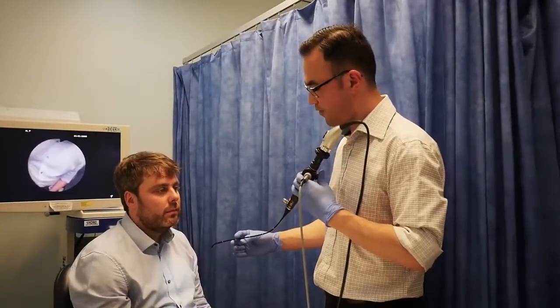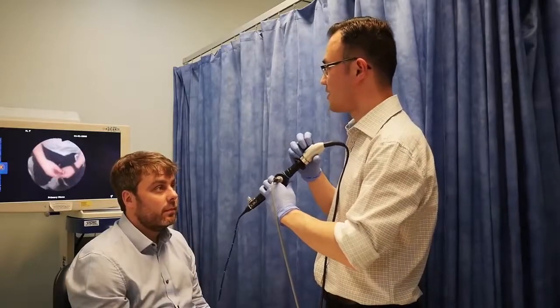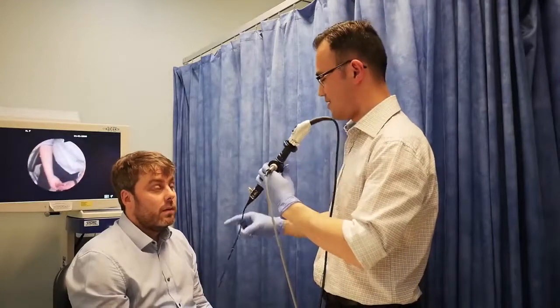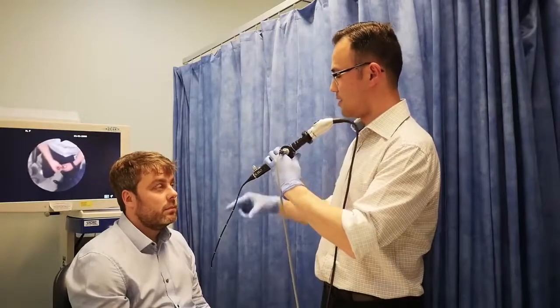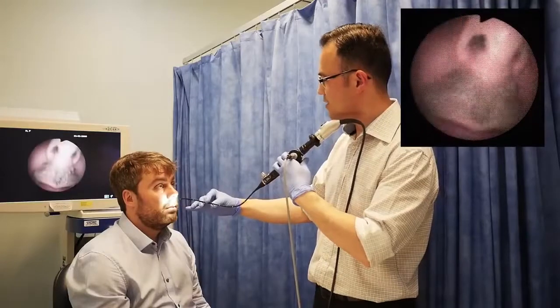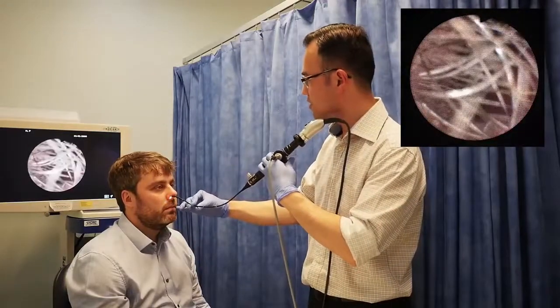Okay, we're going to pass now to Phil's right nostril. Again, just check that the orientation is correct. Again, it's just a natural viewing angle. I'm just going to insert the tip of the scope into the nose.